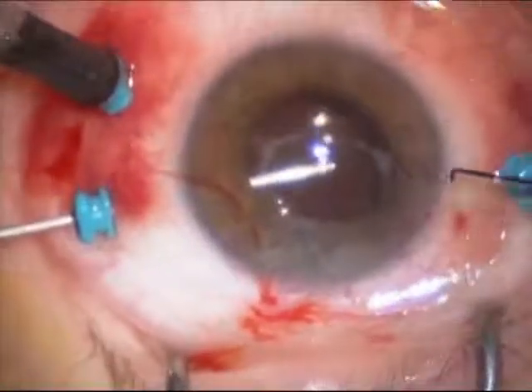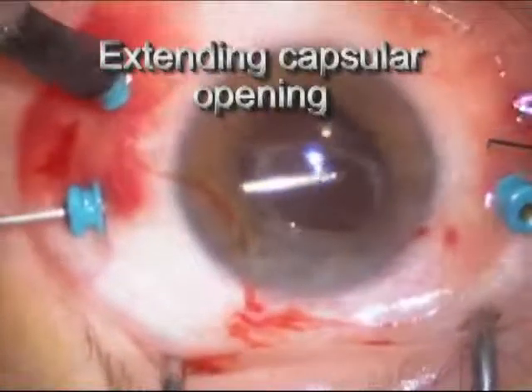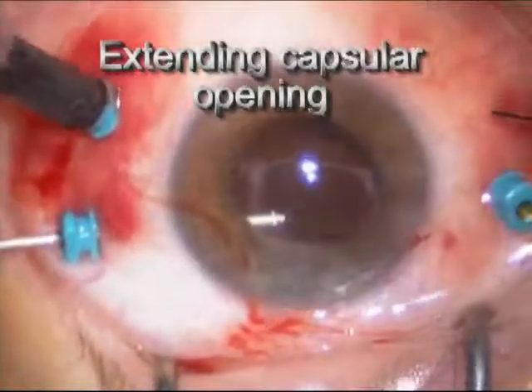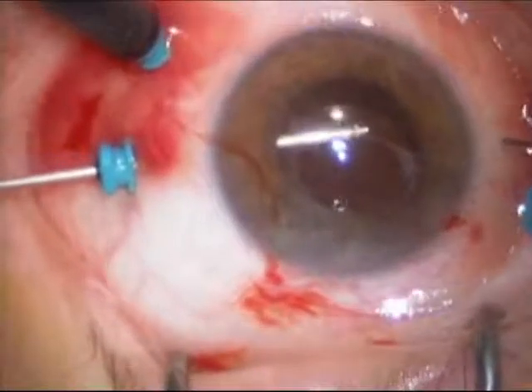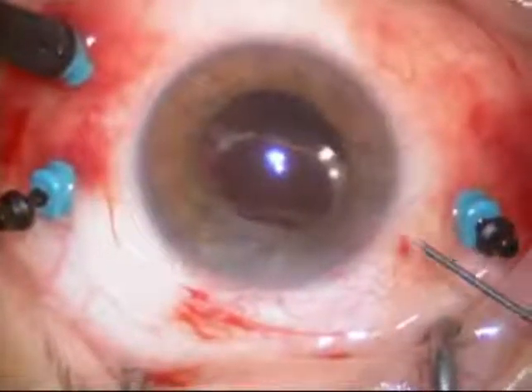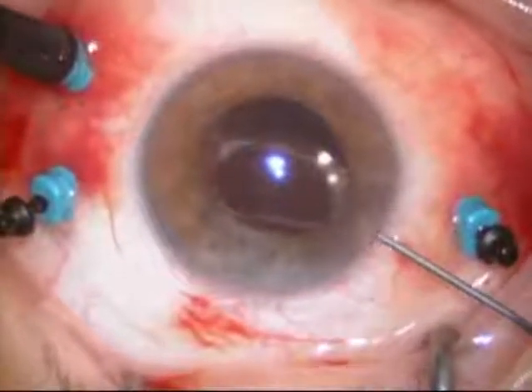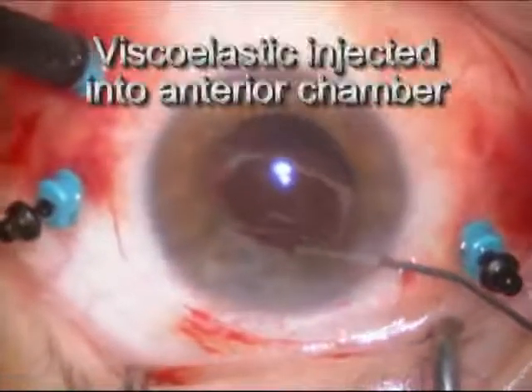There are many different ways to stabilize malpositioned intraocular lenses. What I'm doing here is opening the capsule a little bit more than it's already opened. The capsule is a film of tissue in the back of the eye which is left at the time of surgery to stabilize the intraocular lens.